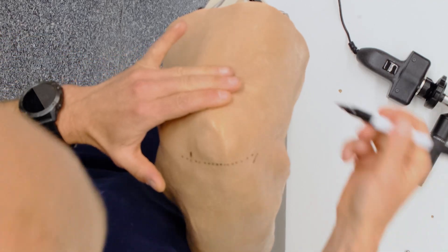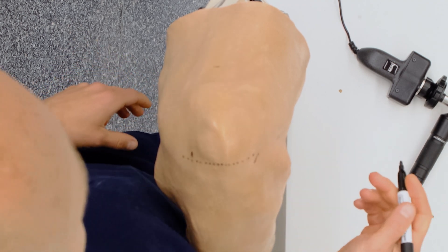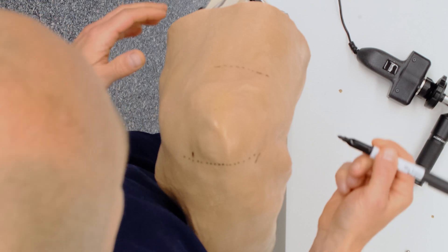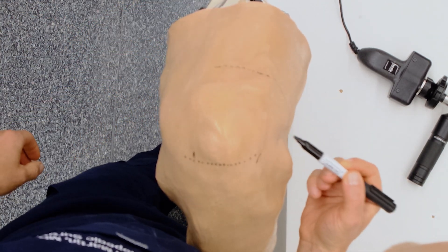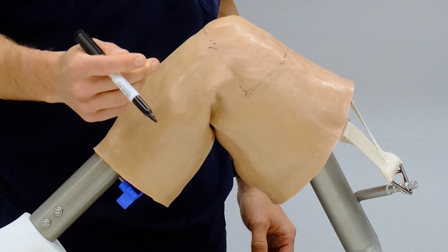One of the clues I use is three finger breadths above the patella at close to 90 degree flexion, and I draw a line perpendicular to the line of the femur along those Langer's lines. Those will naturally meet in an area that's appropriate for the posteromedial portal.